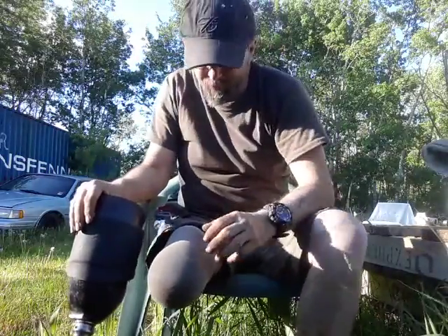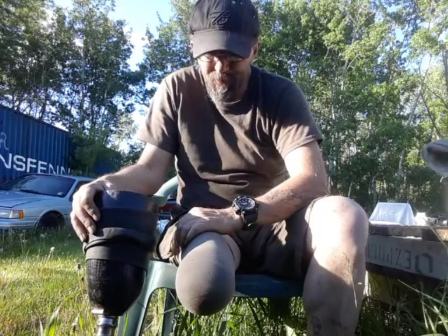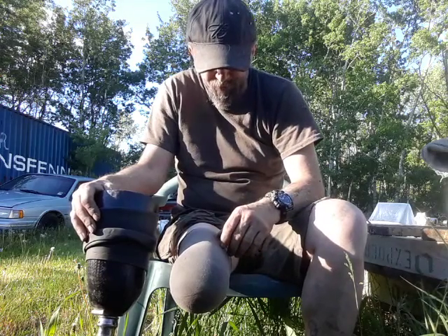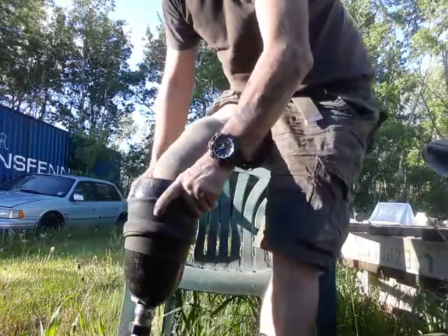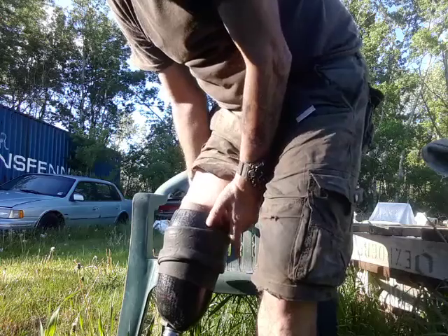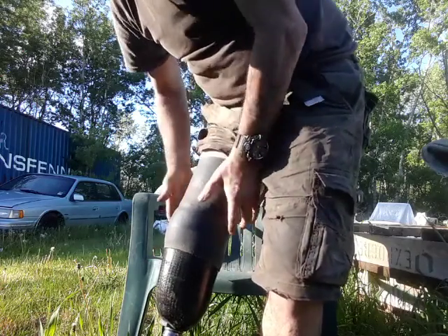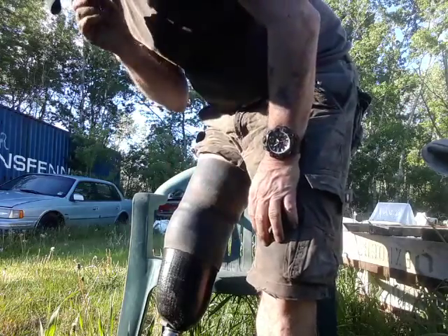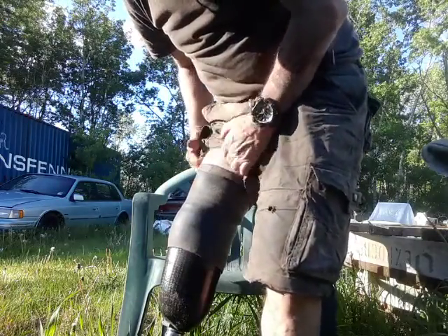Hey, how's everyone doing today? I want to talk about liner height. In some of these groups I'll see liners that are pretty high, and then the sleeve is just barely coming above the liner. As I'm concerned — and I have been an amputee for over 30 years — you want your liner to come up just above the socket, just above it. That's it. You want as much of this sleeve in contact with your leg as you can possibly get. If the liner is too high, the sleeve is not going to be doing a proper job.